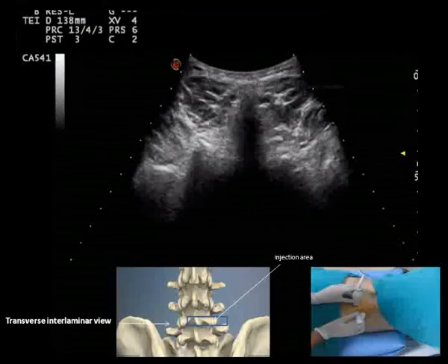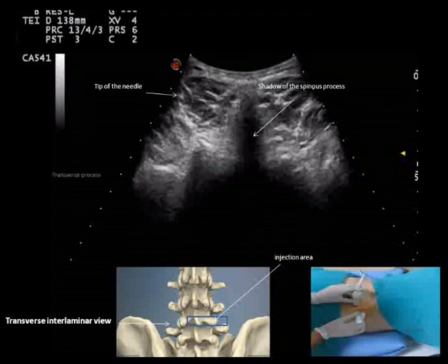The patient was positioned prone with a pillow in the abdomen. Under transverse sonographic imaging of the facet joint, a 22-gauge spinal needle was inserted lateral to the probe at a 45 to 60 degrees angle using a direct in-plane technique.